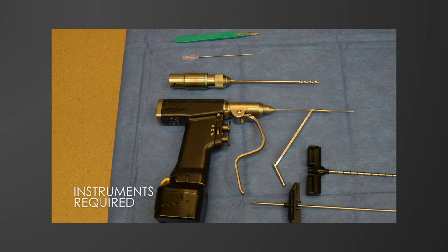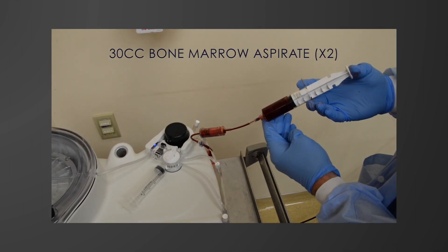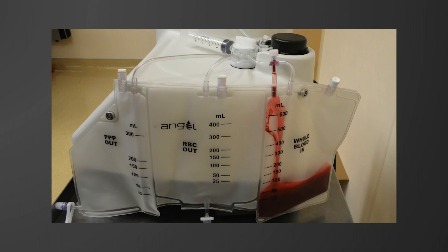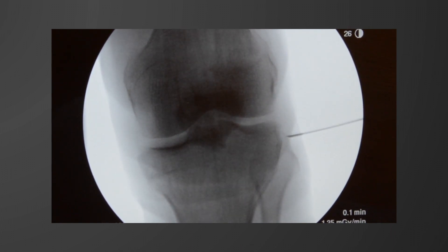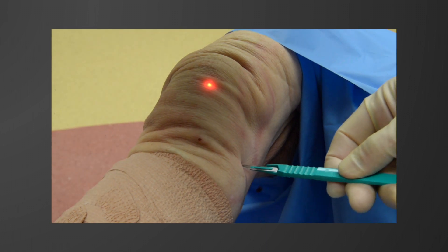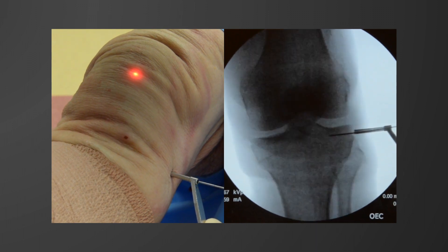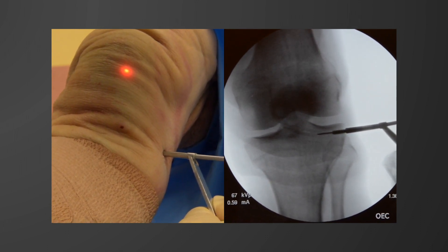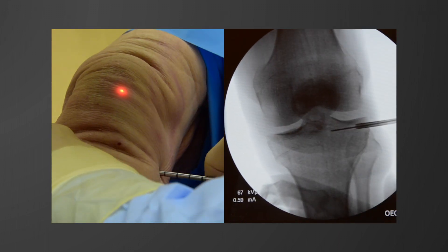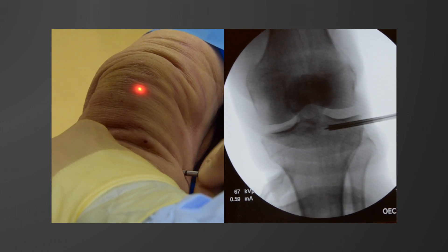This is a short video on the technique. These are the equipment that you need: just a standard drill, a guide wire, and some type of DBM injector/mixer. This is bone marrow aspirate — currently I'm using more typically 50 mils instead of 30. This is the Angel unit separating the different components out. I'm trying to position the approach collinear to the plateau so I can stay just parallel to it. I certainly don't want to get inside the joint. This is my guide wire, and after the guide wire I'm using a cannulated drill. This case uses a 3.5, and then I'm using the sharp obturator with a standard cannula with both end and side flutes.